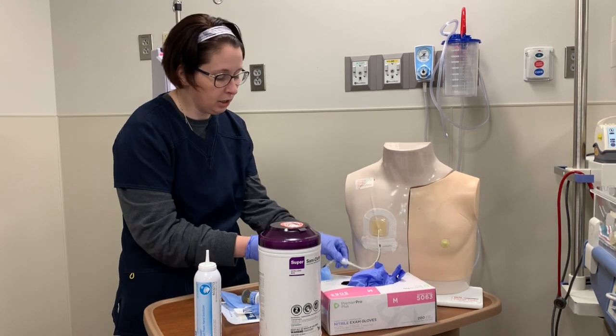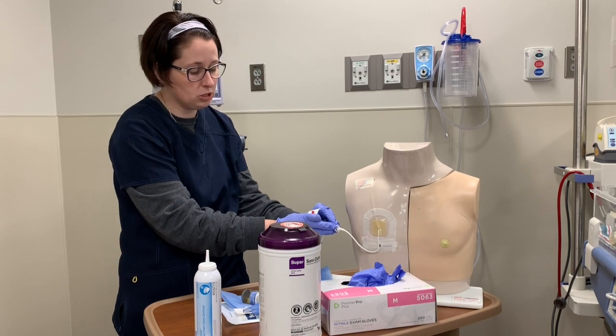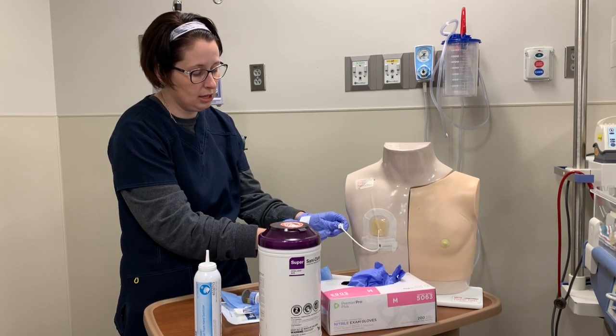I'll clamp here. Some central lines have markings for where to clamp, so just make sure that if they do, you're clamping in the appropriate spot.